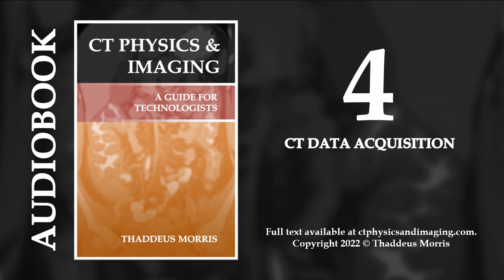The display field of view, DFOV, is set by the technologist based on the localizer images. It can be made larger or smaller, depending on the size of the patient and the anatomy of interest. The scan field of view can be set by the technologist, but fewer options are available. General Electric, that's GE, scanners have just 2 scan fields of view.